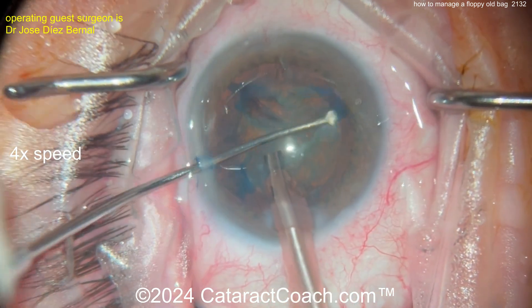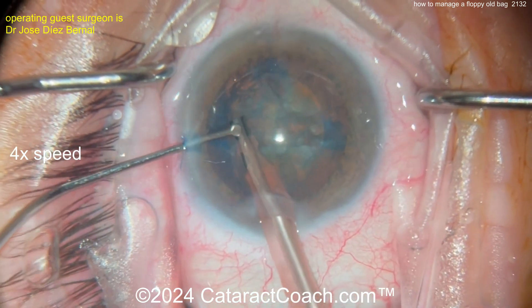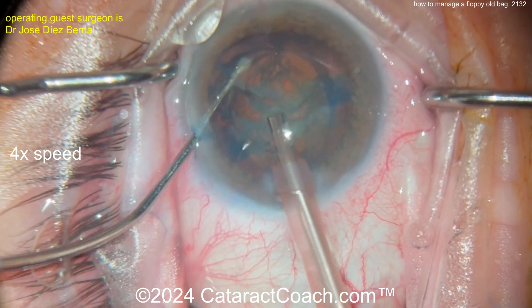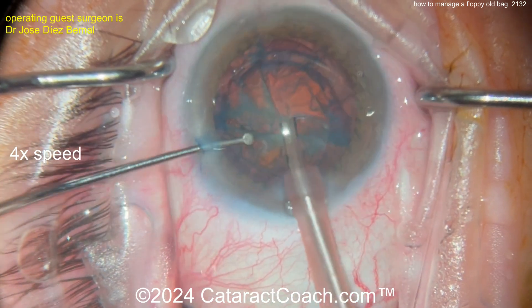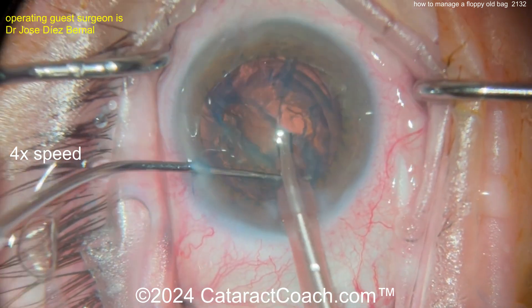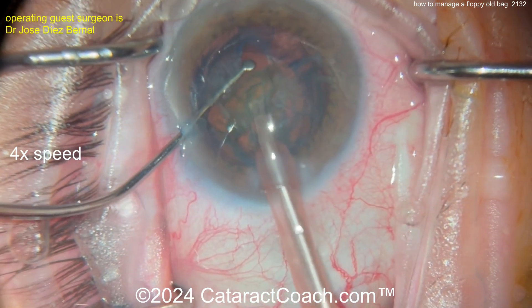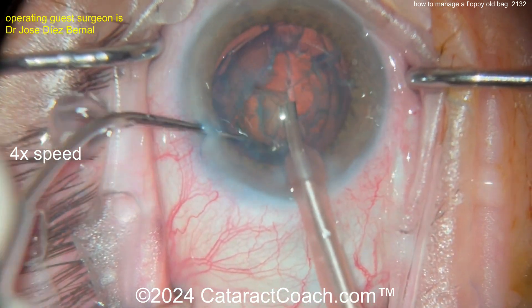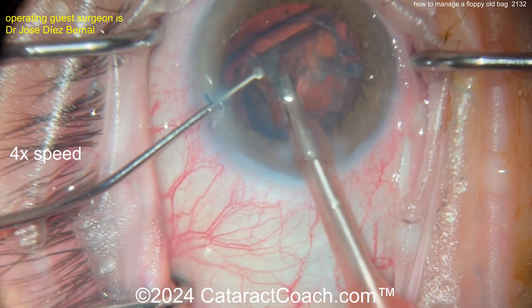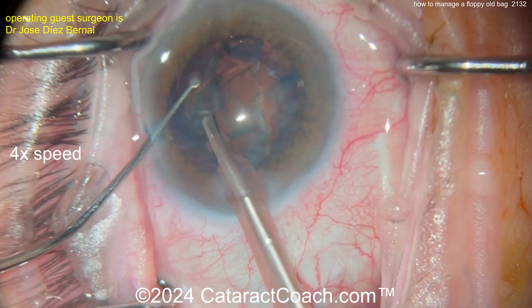Maybe get a quadrant out now, or rotate. In a case like this, I want to minimize rotating inside the bag — I don't want to stress out the zonules any more than they already are. Look how the rhexis keeps moving — that's your big clue. The rhexis should not move, but it is moving a lot. Watch the rhexis — that's the key. Now taking out the nuclear pieces: half is out, here comes the other half. Bring it up, maybe a little chop if you need to.